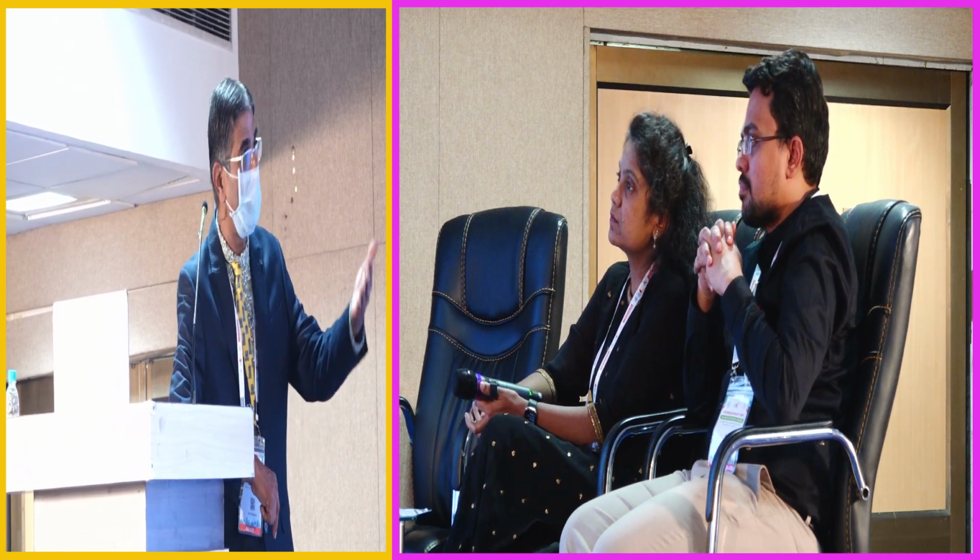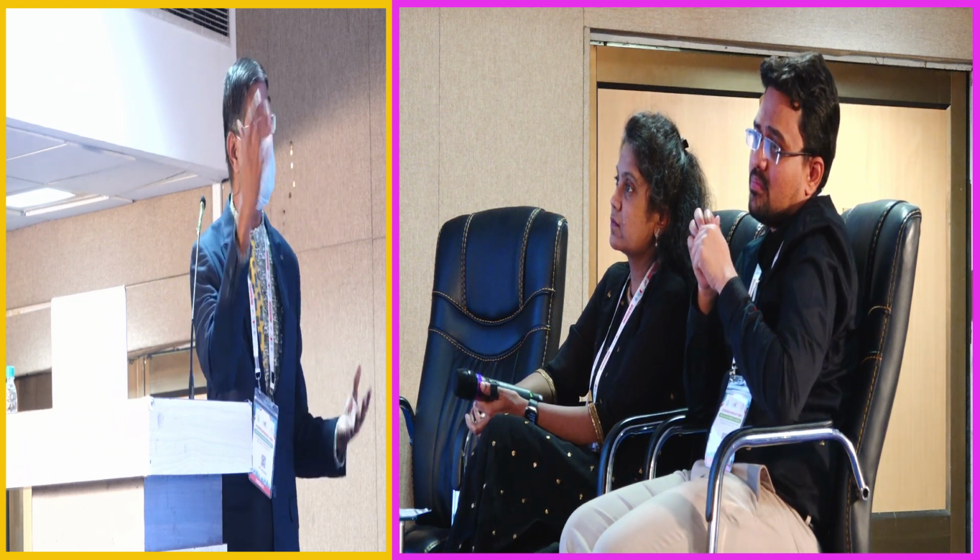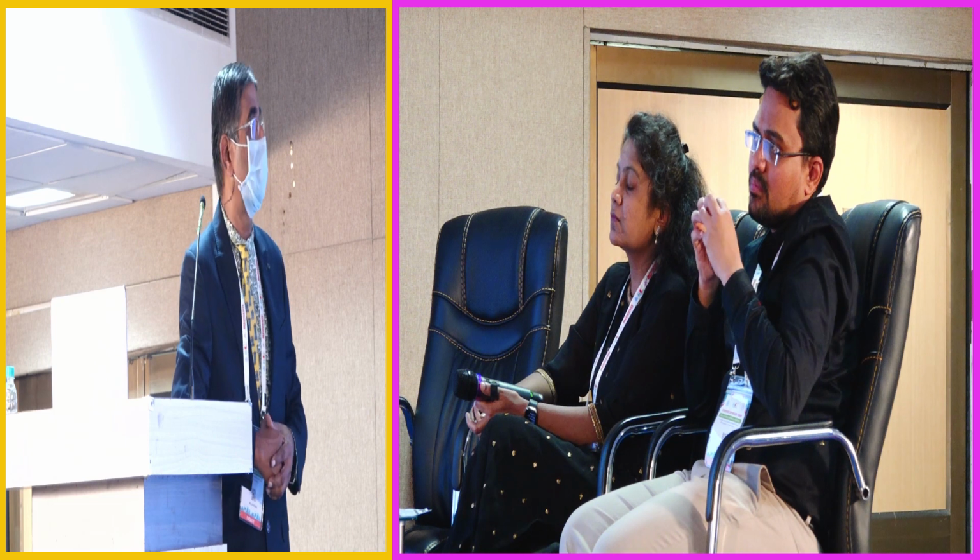My experience in an ICU setup I have done recently, 11 hours I have done HF. Of course, it was Indian RO system, then I put a portable one. And I didn't go into the auto mode. I went into manual, like you do the CRRT calculation, 25 ml per minute. You can do that also. Why I didn't want to use automated mode is because automated will try to increase sometimes and my filter will go. I wanted a gentle one and it was an ICU setup and I managed to do that. This is my experience.